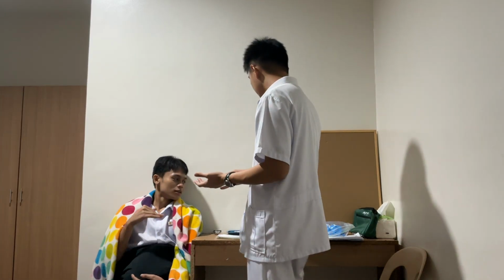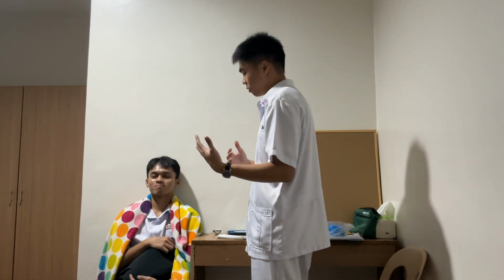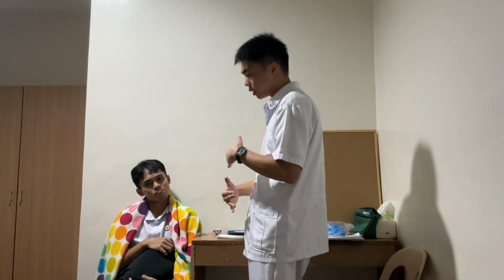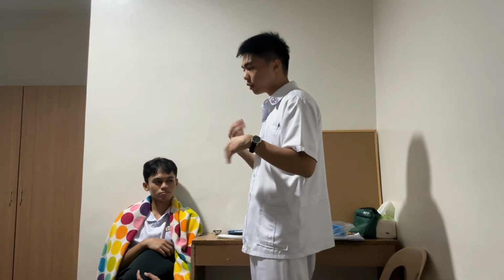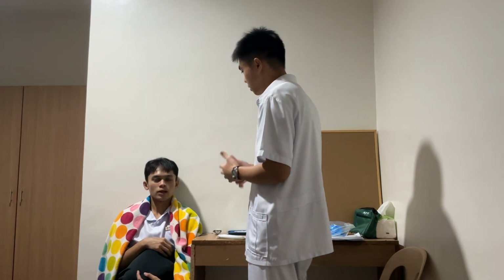Okay, so for the last one, the last vital sign we're going to take is the blood pressure. So this is very important. This will serve as a basis or background for your blood pressure, so that if there is anything out of the ordinary, below, hypotension, or above, hypertension, then we get to compare findings. We can check again and ensure if this is actually your blood pressure as well.